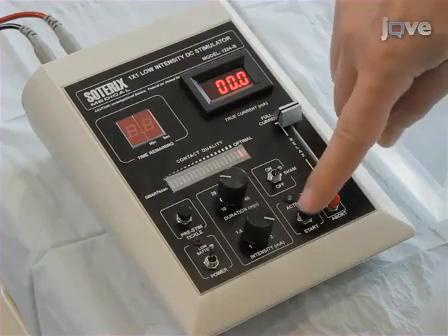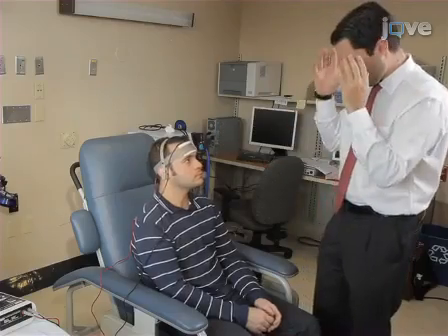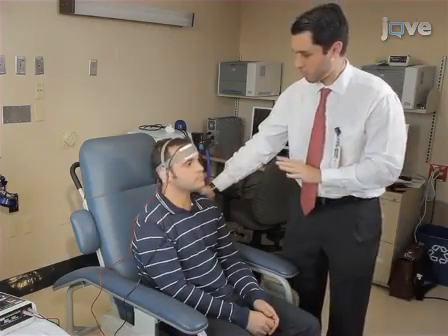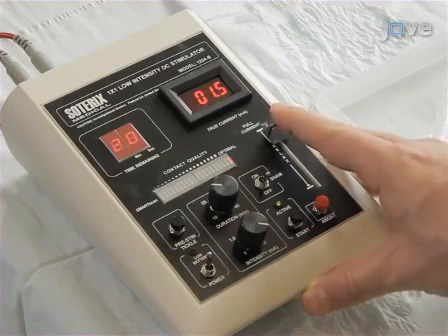Now, initiate the TDCS by pressing the Start button. To reduce any adverse effects, start by ramping up the current flow. At the beginning of stimulation, the majority of subjects will perceive a slight itching sensation, which then fades in most cases. Some subjects may experience discomfort during the initial TDCS period.